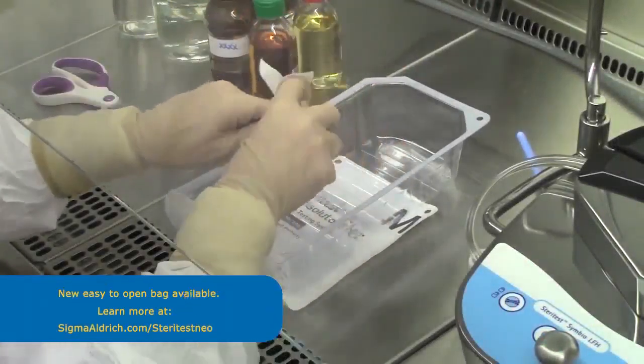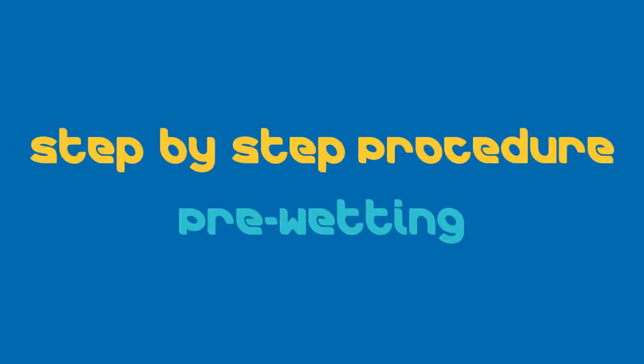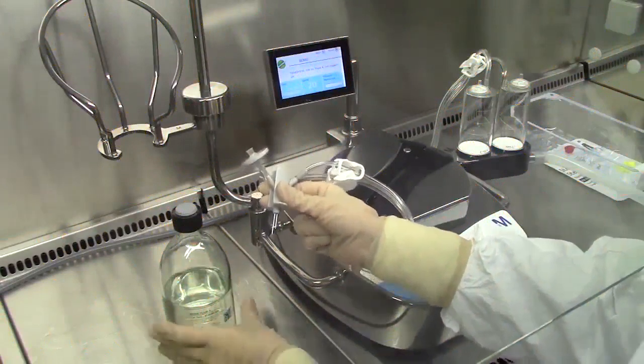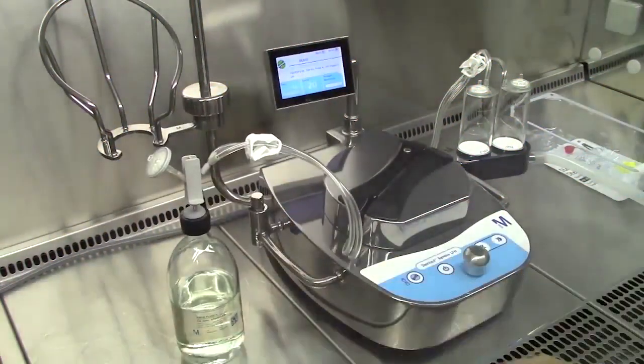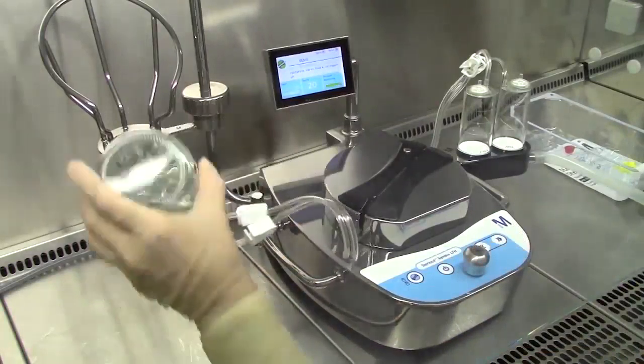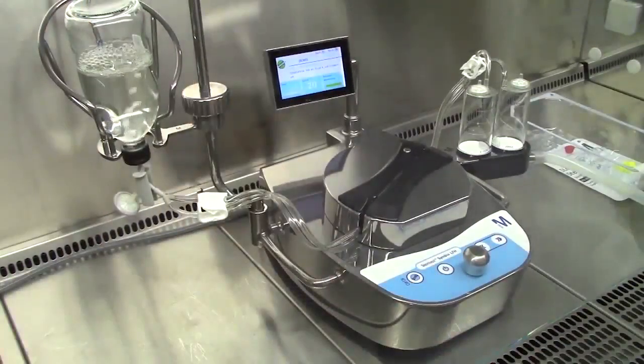Empty the plugs from the accessory bag into the blister. At this step, a low speed is recommended to maximize the contact time between the pre-wetting fluid and the filter membrane. Aseptically insert the tube set needle through the septum. Start the pump. Keep the pump running, and after a few seconds, turn the rinse container upside down and place it in the bottle holder. Allow the transfer of 50 milliliters per canister to pre-wet the filter.